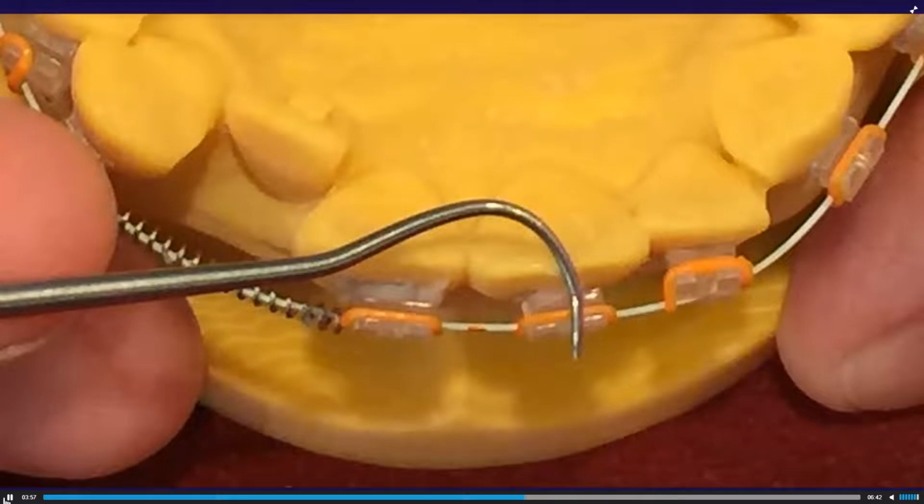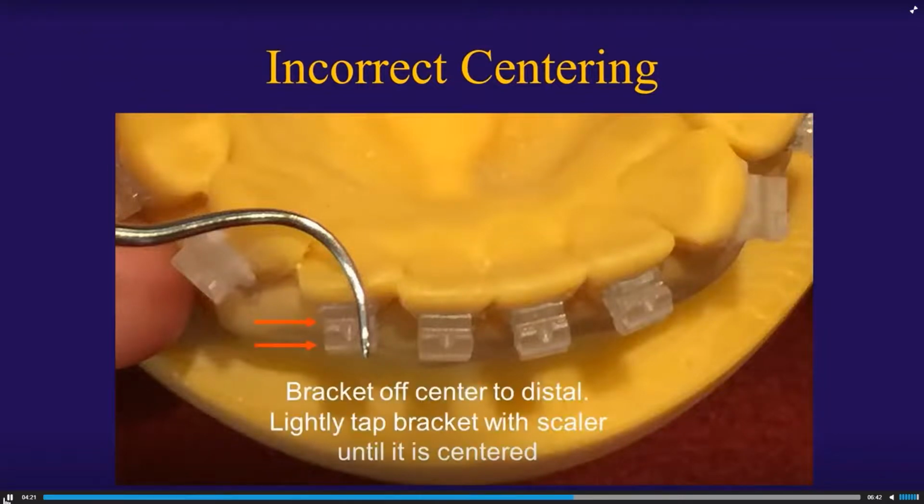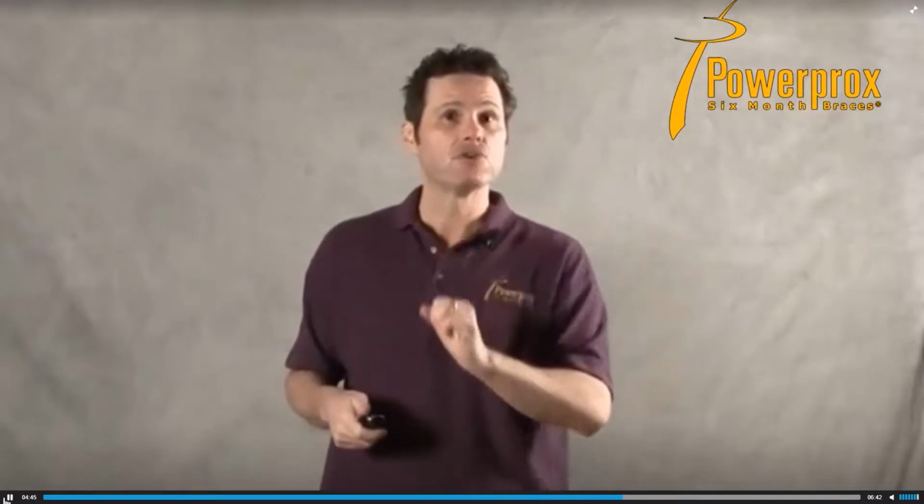And take your instrument and put it right on there, okay? Whether it's a perio probe, sickle scaler, explorer, whatever you're going to be using to clean up the extra cement afterwards works great. Double check that centering. That's exactly what I do chair side. Okay, and if it's off center, like this bracket here is off to the distal, right? All you have to do is tap that bracket a little bit to glide it over to get it in the proper position. Now, this is one of the reasons why I prefer orthodontic cement as opposed to flowable composite. Flowable composite, you tap that bracket, it has a tendency to really glide on you. With cement, you have much more control for those fine-tuning movements.